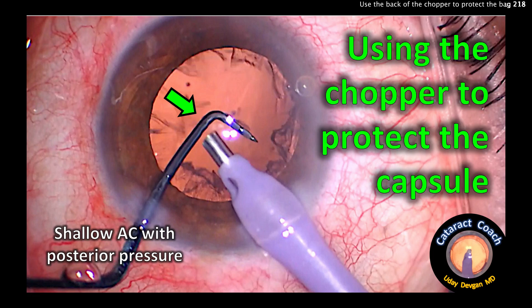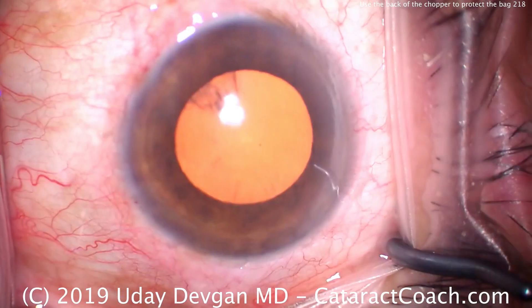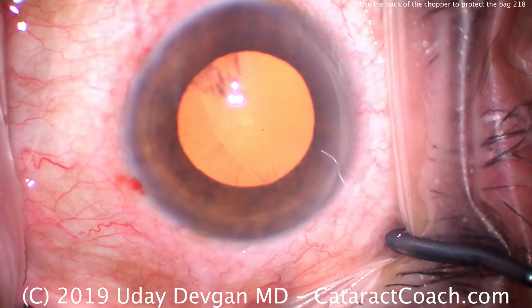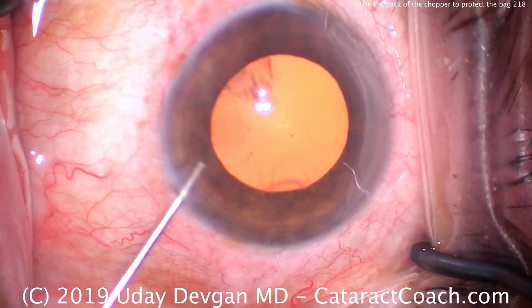We're looking at a case where we're using the chopper to protect the capsule. I do this a lot in my videos, and I want to show you this case unedited. This is an entire cataract surgery start to finish — it's only about five minutes.